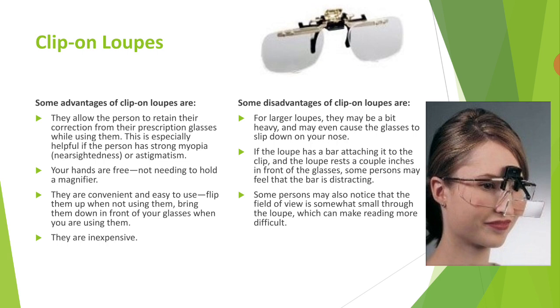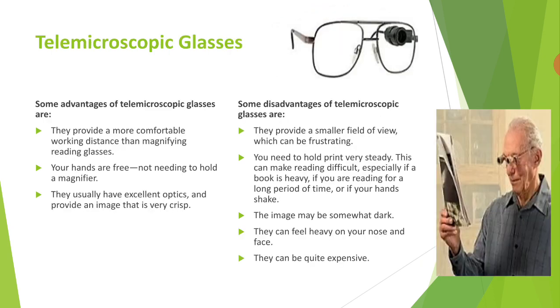So there are disadvantages when your patient uses the clip-on loops. But if they want something easy, you can put it in your pocket. So anytime, the patient can use this. Okay?